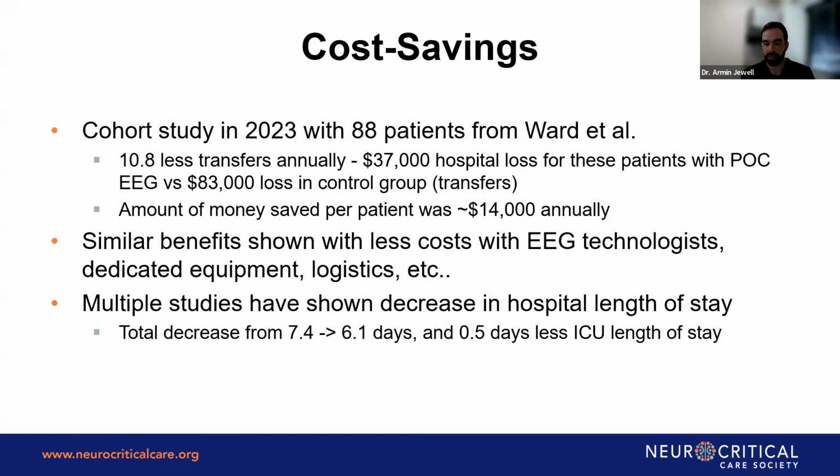So that was a significant number of less transfers. And by transfers, what they were mentioning were people who were needing to transfer the patient to a more tertiary hospital for conventional EEG, and they were able to not transfer them with point of care EEG at their hospital site.